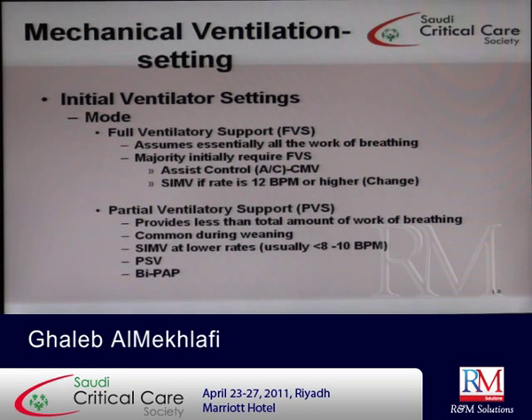Is it full ventilatory support? Then you will use a control mode. If it is partial, then you will use partially supporting modes. In full support, you will assume essentially all the work of breathing will be delivered by the machine, and the majority initially require full ventilator support. Usually, because we anesthetize the patient before intubation, you need full ventilator support initially, and then after that you will modify according to the patient's situation.